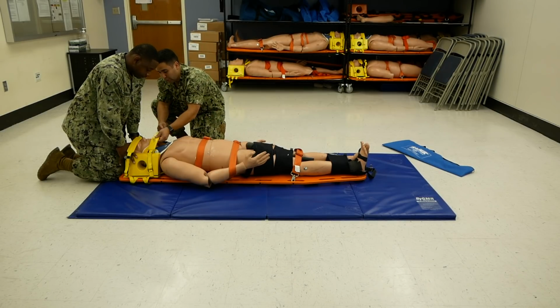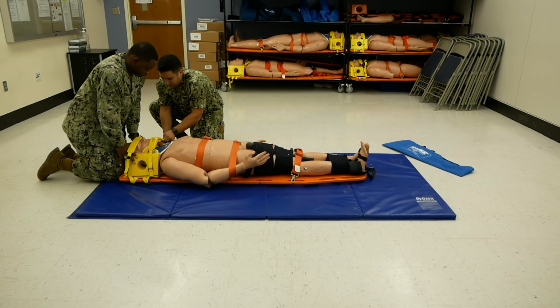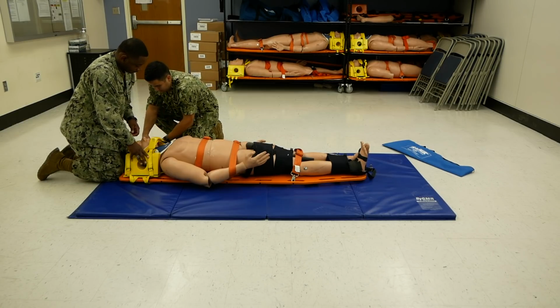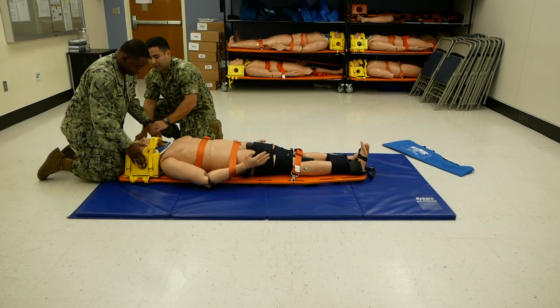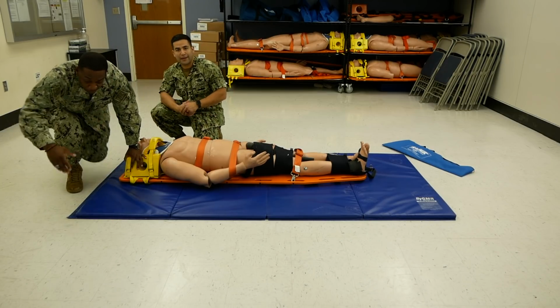And then one over the forehead. Yeah, that's good. Once the patient is strapped in and secure, your assistant can release manual C-spine stabilization.